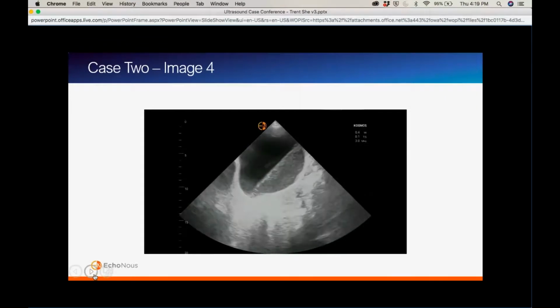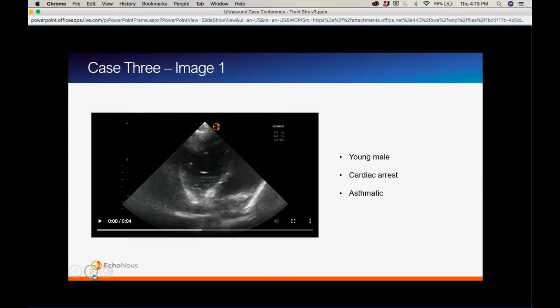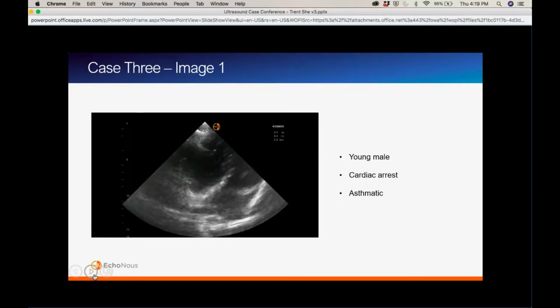Yeah, absolutely. So no, I totally agree. It was just a crazy UTI. So UTI. What about this case? You think it's AAA, and it's of course UTI.